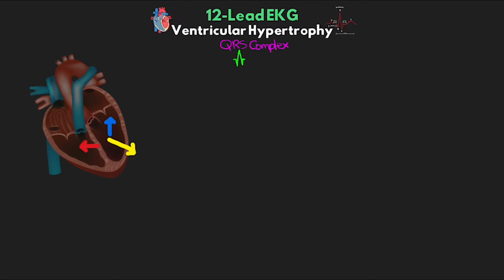So if we look at this from the frontal plane, let's say if we're looking at lead 2, we can see with our complex here that each of the directions of electrical activity contribute differently over time to the waveform that we see. As the colors blend together, this signifies that we don't just have discrete events of electrical activity, but they're all happening together over time and flowing together.